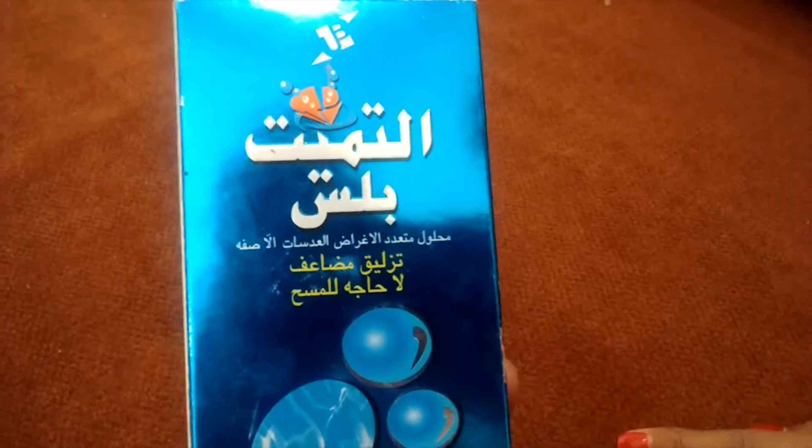They also have Arabic instructions on the packaging. They have the ingredient list, and the precautions say: do not use if you are allergic to any of the declared ingredients mentioned above. The ingredients are very complex to read, so I am not going to go through those.